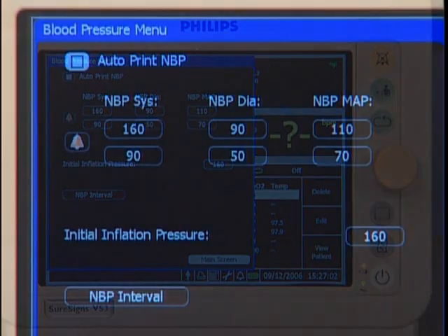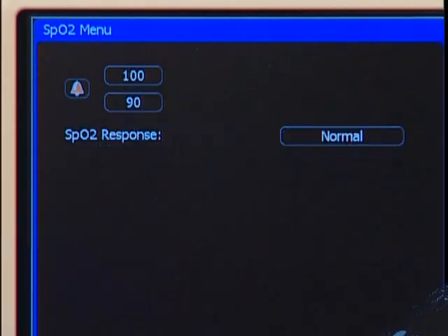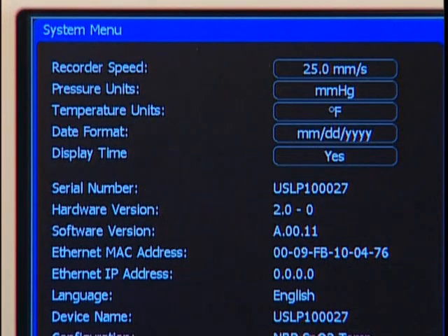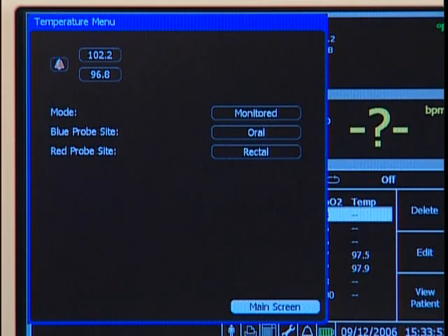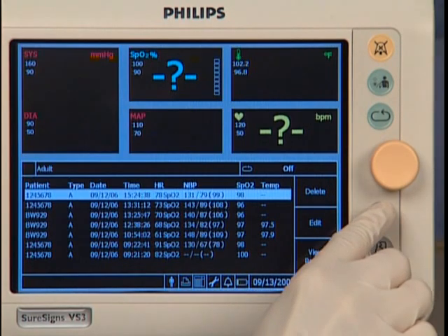In an open menu, you can change settings by highlighting an item and then pressing the wheel. Turn the wheel to change a setting and press the wheel again to select it. Using these same steps, you can make changes to any of your measured parameters including alarm high and low settings, or system settings such as default patient type. Highlight main screen in the menu or touch the main screen button to close the menu window.